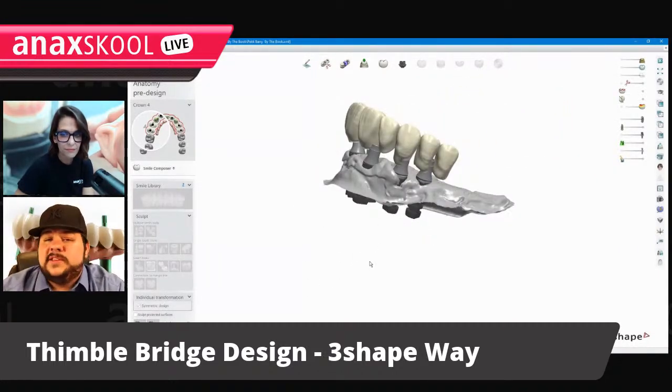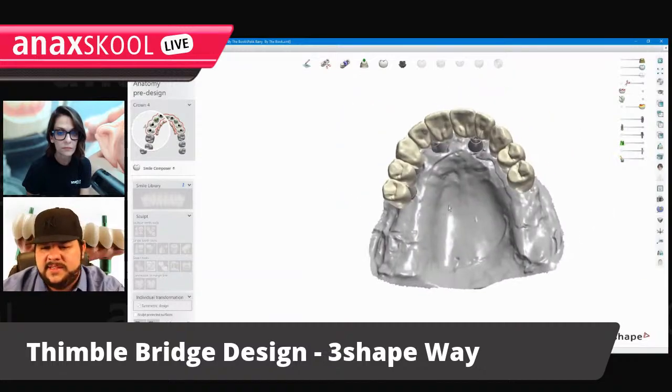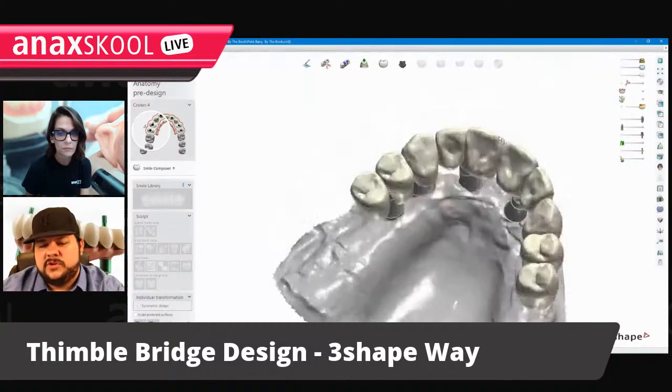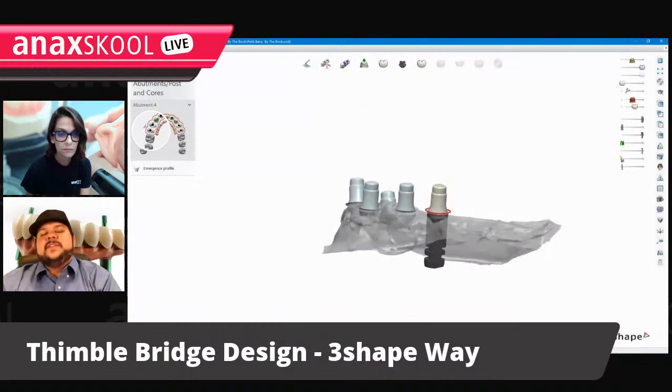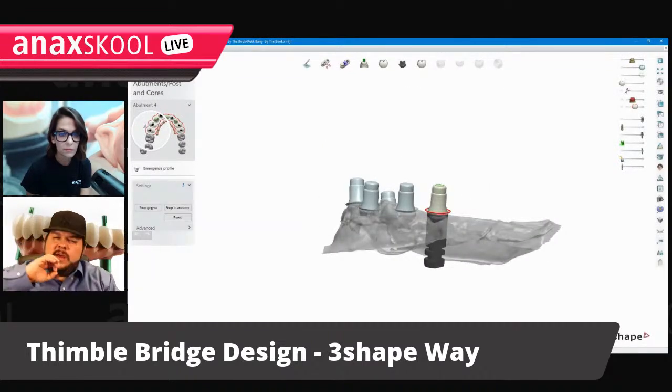So you'll jump into this part. Now, it's grayed out because that's already been done. If you didn't do anything yet, your original order shows up just like this and you just hit next. These were the original teeth from the original design from the diagnostic and prosthetics plan. But normally, if you don't have anything, that's the step where you're going to sit there for 4 hours and design everything to a T, every little bit of texture, go through excursive movements, dial in. Some people want to do it in 10, but for me, it's 1 hour to 4 hours.